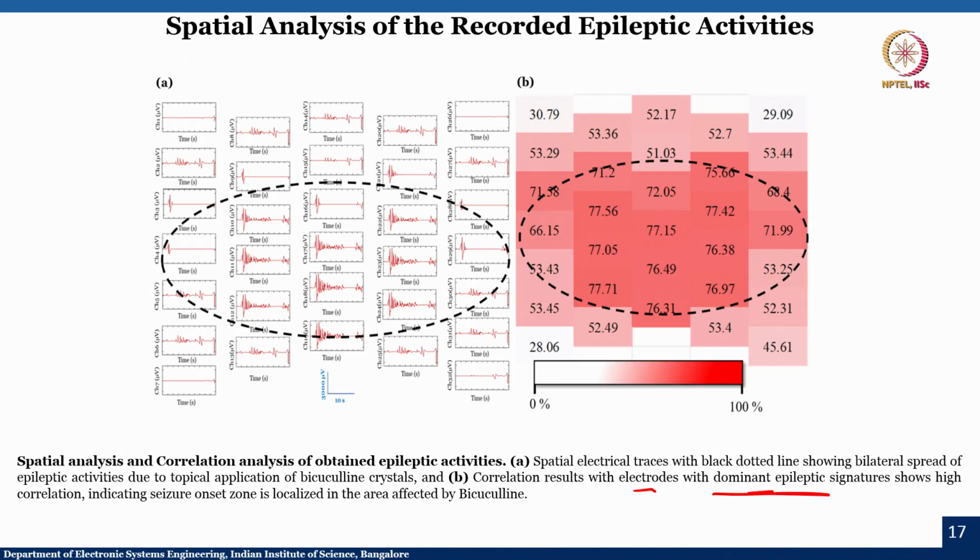Very interesting. Let us see the next set of the microelectrode array for some other application. Here we can understand that if you have 3 different drugs and you place the electrode, you can test all these 3 different drugs to see which drug is more effective. That means the efficacy of which particular drug is higher compared to the second or third drug. This can be used by the pharmaceutical industries to test a drug and see its effectiveness.